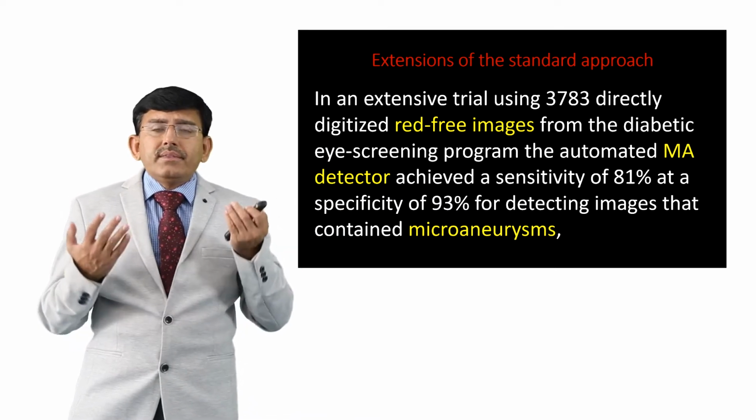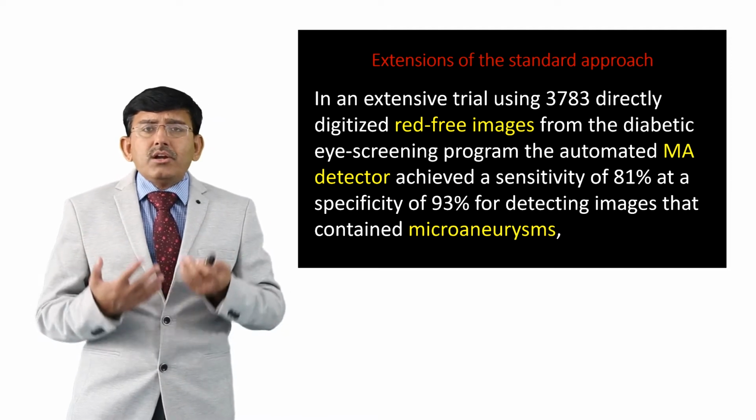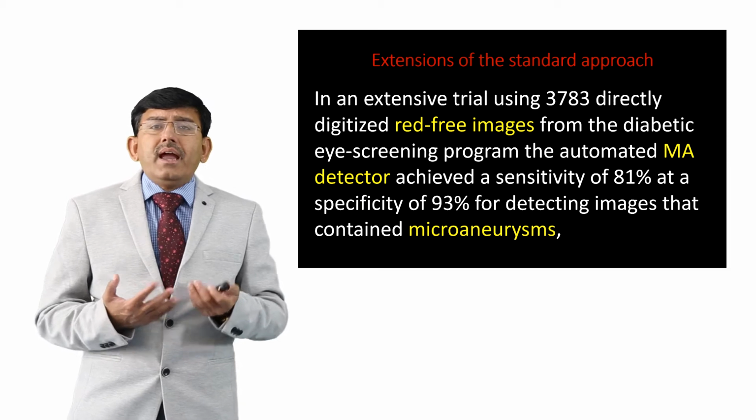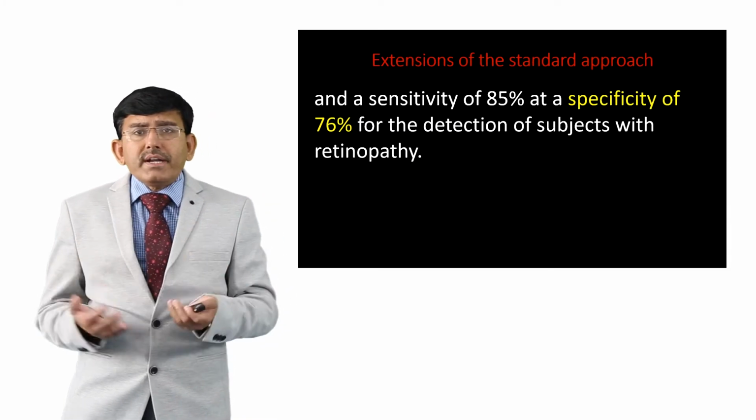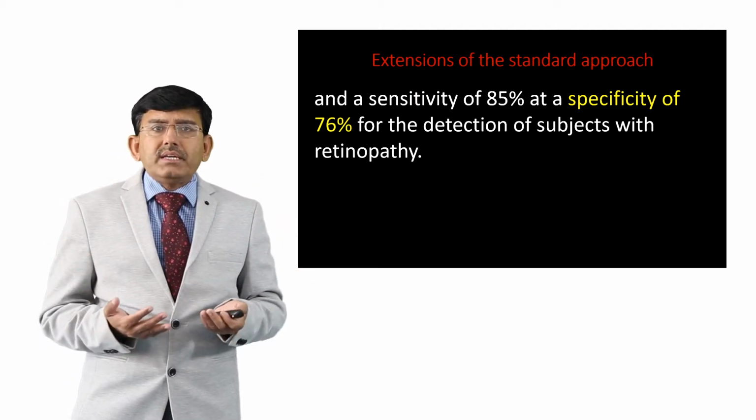By using this method, it is possible to get a sensitivity of 85% at a specificity of 76% for detecting the subject with retinopathy.